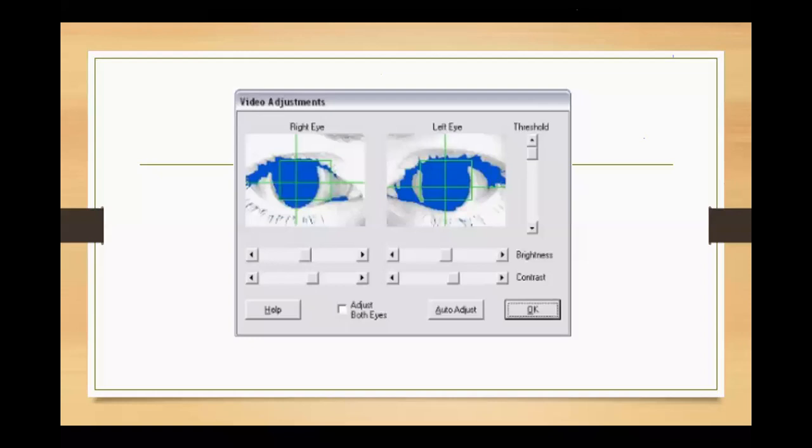There are also a few adjustments, like eyelash curlers. So the eyelashes will be curled upwards so that they don't come in the way of our recording. This is also possible. If the eyelashes are very long, we used to stick them back, or we used to curl them. If it's really unavoidable, then ENG is the best option for us.